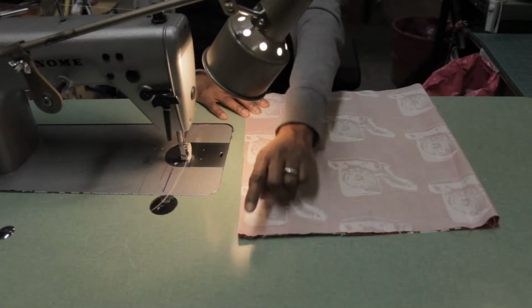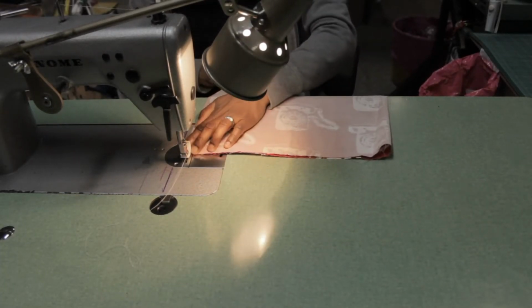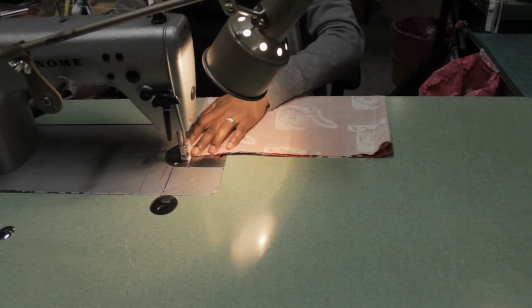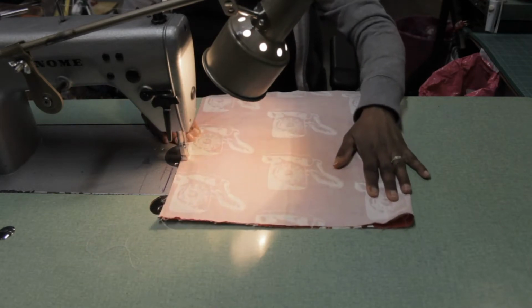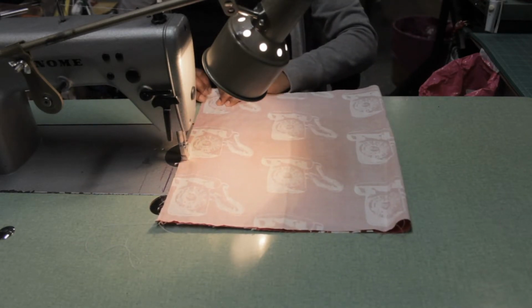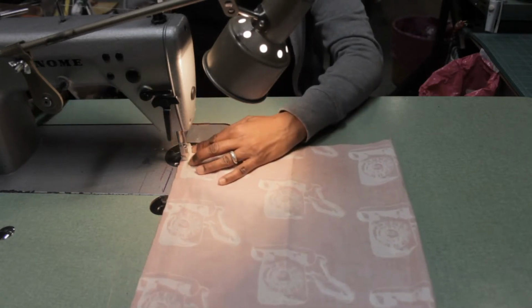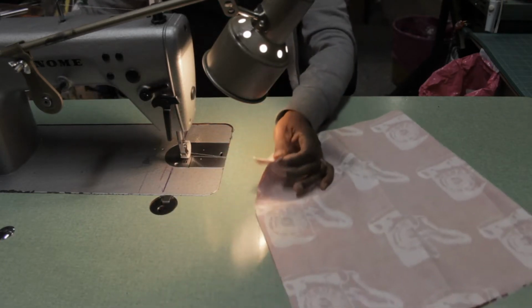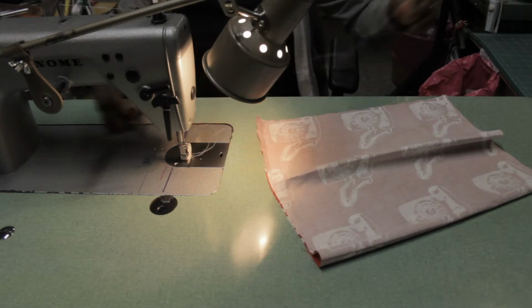Alright, so we're going to sew our 1/4 inch seam here. Again, at the beginning, we do a small back tack, a few stitches, and we're going to sew a 1/4 inch seam all the way to the end. Make sure that the seams are together, and we back tack, and we clip our seams nice and clean, clipping our threads.